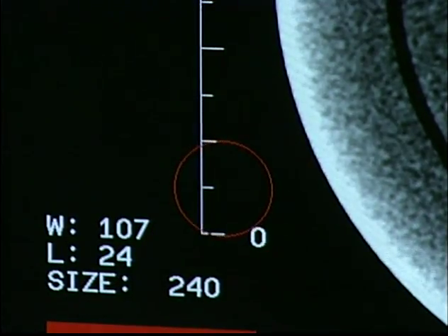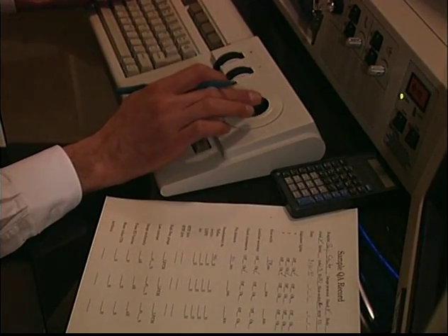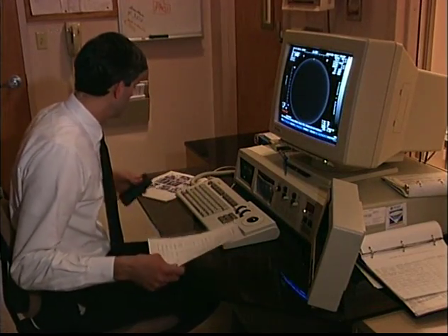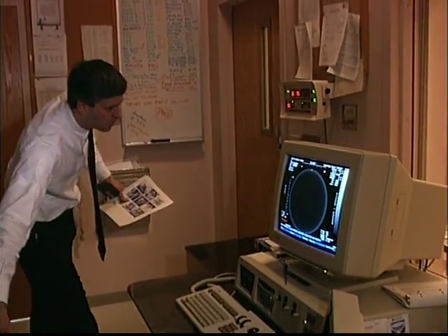To measure the noise, select a constant ROI size from 2 to 4 centimeters in diameter and set your ROI cursor in the center of the image. Make your measurement using the scanner's noise standard deviation function. With some practice, a typical quality assurance procedure, such as we've seen here, can be performed in 15 to 30 minutes. Such tests are critical to verifying the integrity of a scanner.